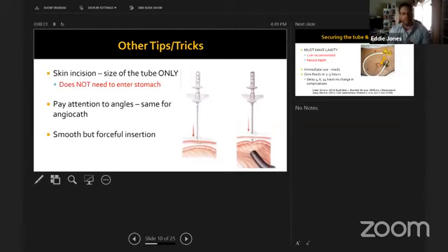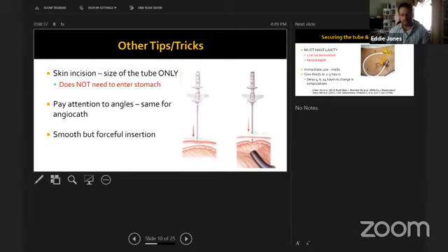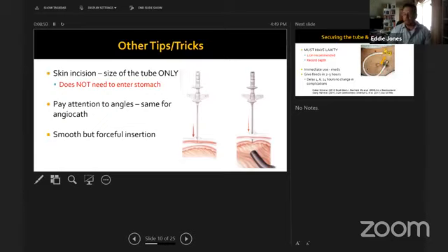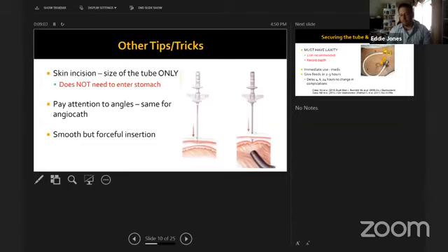When securing the tube, one centimeter of laxity is critical — some papers recommend two centimeters. Dr. Jones's approach: with gentle upward pressure on the tube during the procedure, note the skin level. Add one centimeter to that measurement for the lower bumper edge. Report the upper bumper edge (lower edge plus the one-centimeter bumper size) in the operative report so bedside evaluators can assess it without removing dressings.